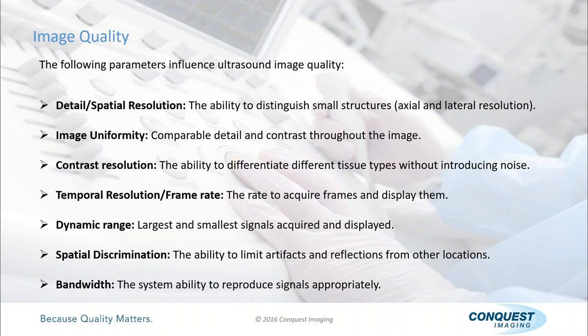And how do we do that? Because we're looking for what we call a time delay. So we transmit with a known time associated with it. So we're targeting a specific depth. And then we wait for an echo to come back at the exact same time, right? So we're targeting a point in space, and we know when the echo is going to come back from that point in space. And based on the amplitude of the echo, we know the density of the object. The more dense, the larger the echo. Does that make sense to everyone? Kind of how that works? So we're doing that, and we're able to determine different densities in that manner.